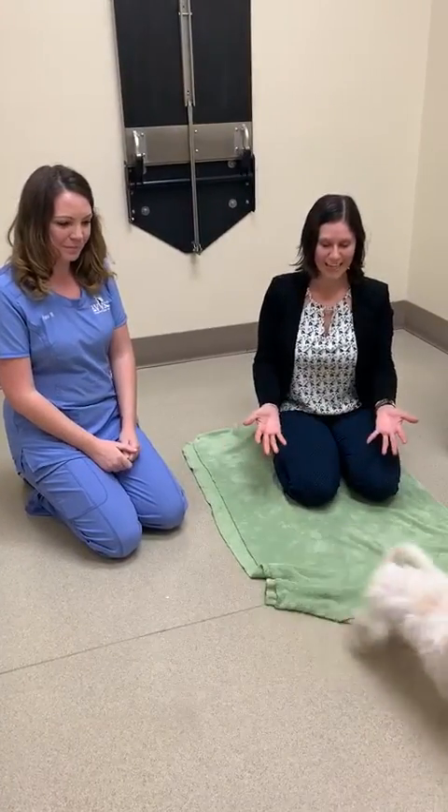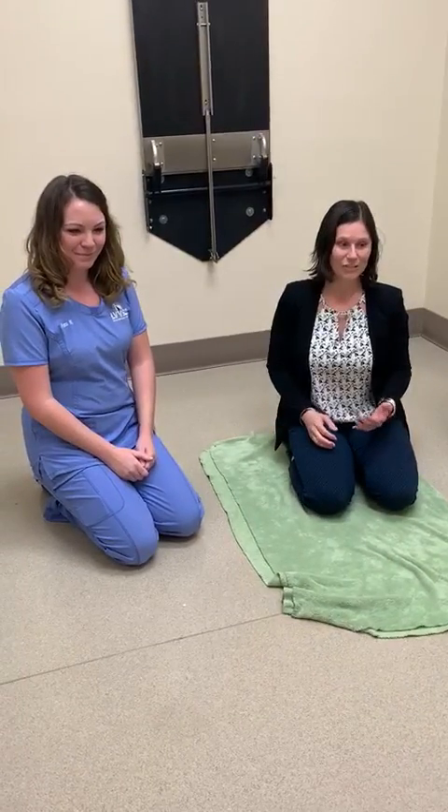Hi there, I'm Dr. Snee. I am here today to show you guys how to do a B12 injection demonstration. This is something we commonly do on our patients in our practice, and we want to show you guys how to do it so that hopefully this can help you do it at home.